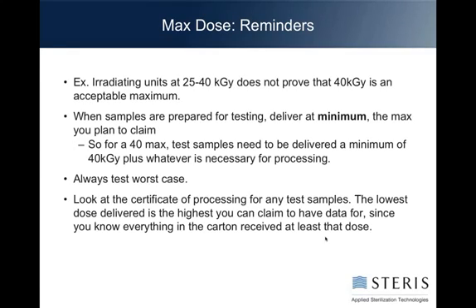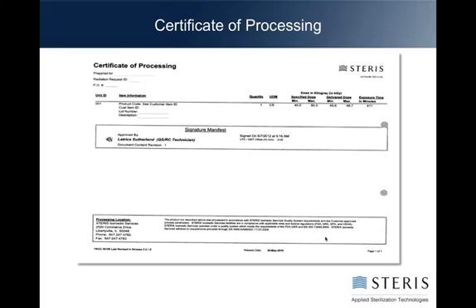Look at your certificates of processing for any test samples. The lowest dose delivered is the highest dose you can claim to have data for, since you know that everything in that carton or box got at least that dose.